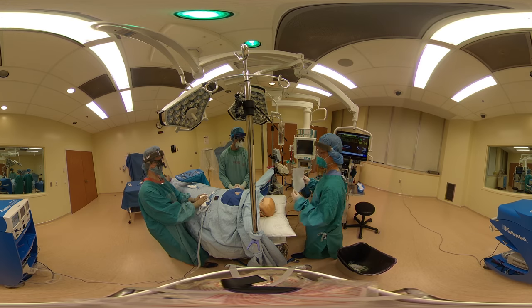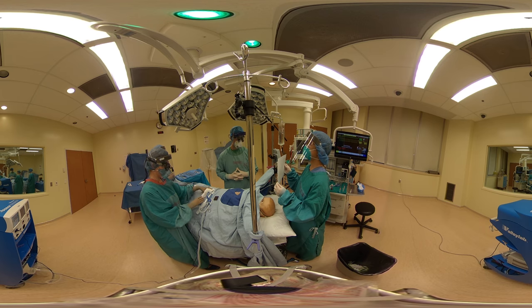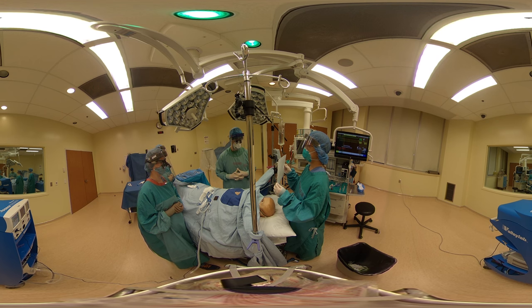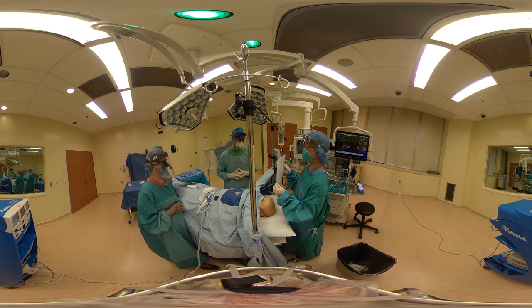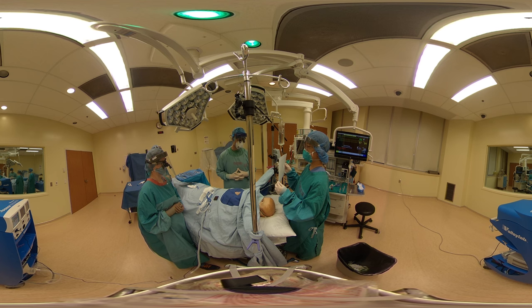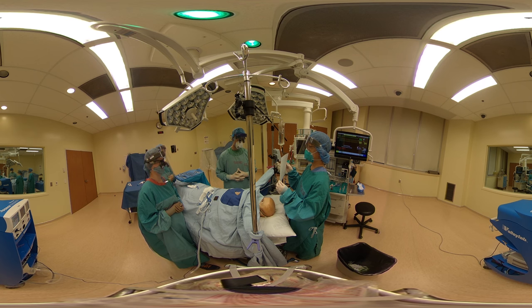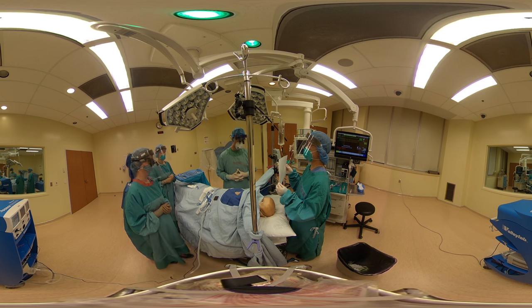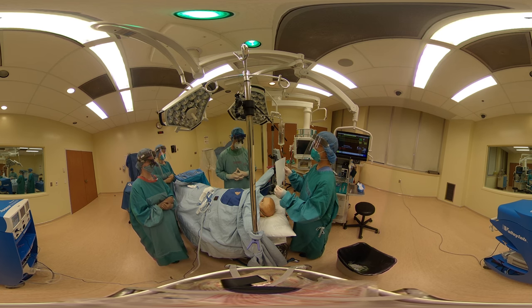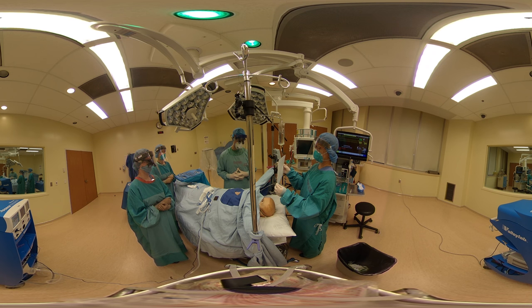Timeout. We've got patient John Doe here for an awake tracheotomy. He has an obstructing laryngeal tumor and therefore is not intubatable and needs an awake trach. He's a suspected but unconfirmed COVID patient. Site is marked. Myself and Dr. Polk will do the case. Antibiotics are in. Patient is supine with neck extension. No imaging to display, no special coagulation measures. VTE prophylaxis has been appropriately administered. Any questions or concerns? No.